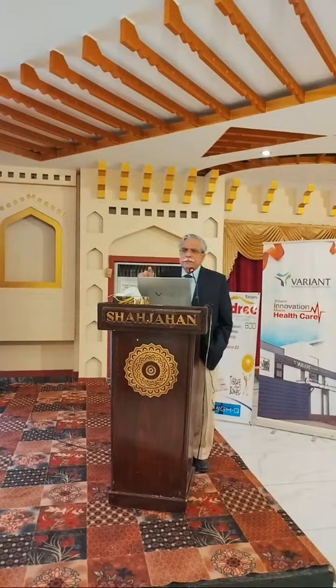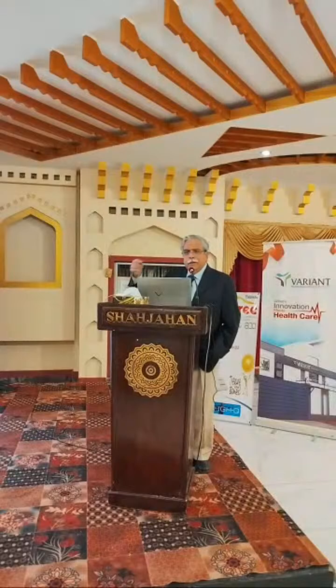Okay, what is this thing about MCA? Now, this is a very interesting thing about fetal physiology. What happens is that as the fetus grows older, the fetus matures, the requirement of nutrition stabilizes, but the requirement for oxygenation goes up. So if you're going to find an abnormality, you're going to find an abnormality in the region of the red graph. The fetus is hungry for oxygen, and if there is anything wrong with oxygenation, the fetus is going to react, and it is going to give you evidence that something is wrong.